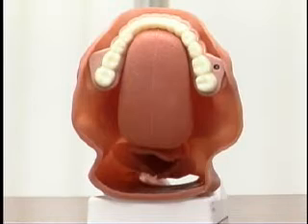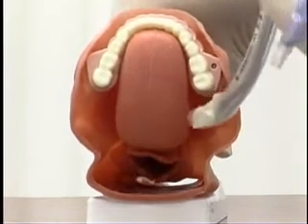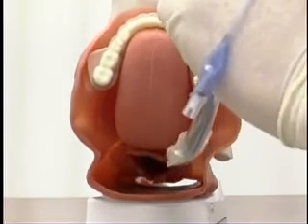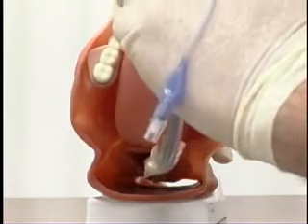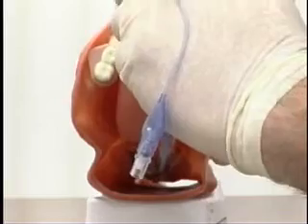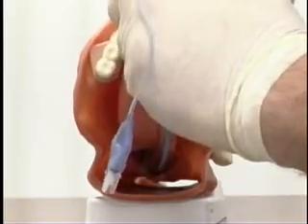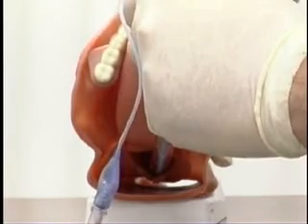No matter what blade you're using, when you're visualizing the vocal cords, you're going to pass that endotracheal tube down the right side. You want to see the vocal cords and pass the endotracheal tube. You watch the cuff — you want the cuff to go just past the cords itself. And that usually confirms proper placement of the endotracheal tube. Thank you.